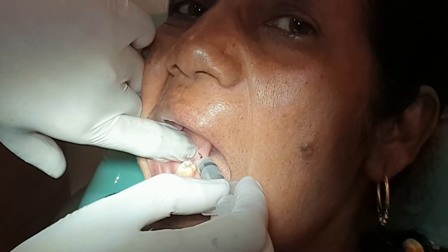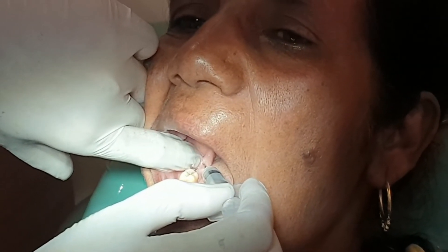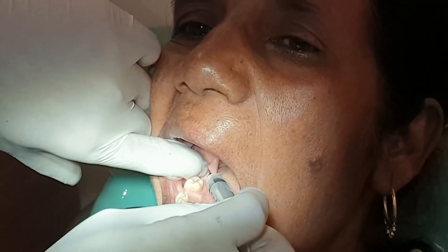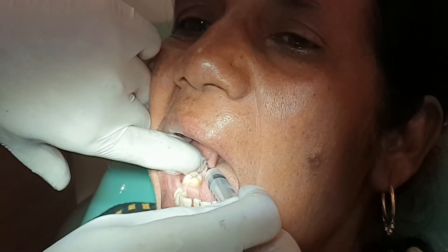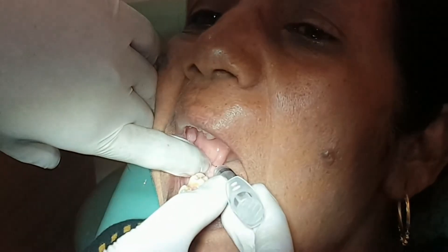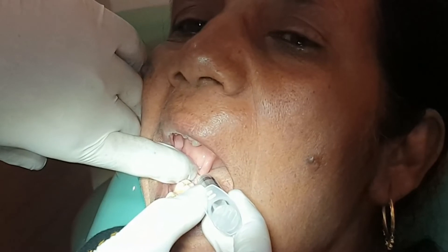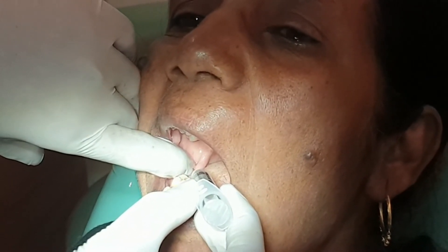After contact with the bone has been made, the needle is withdrawn one millimeter. Aspiration is done in two planes and 1 to 1.8 ml of the solution is deposited. Then the needle is withdrawn slightly and 0.5 ml of the anesthetic solution is deposited for anesthesia of the Lingual Nerve.